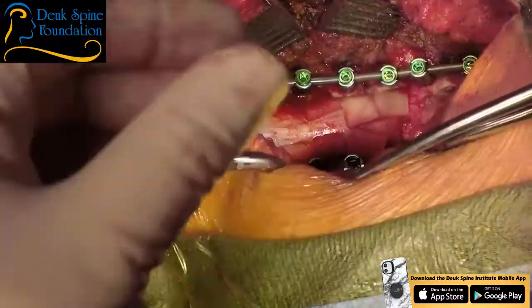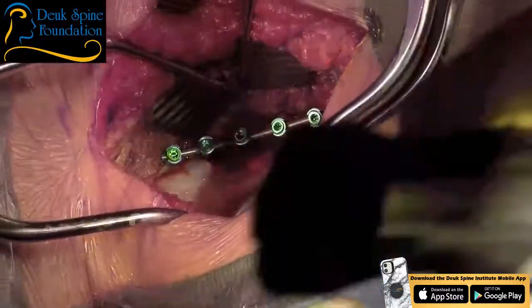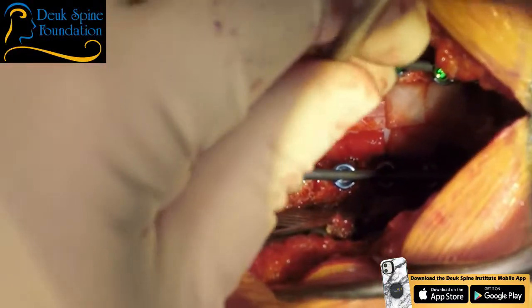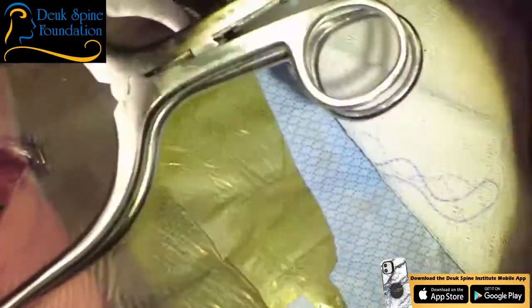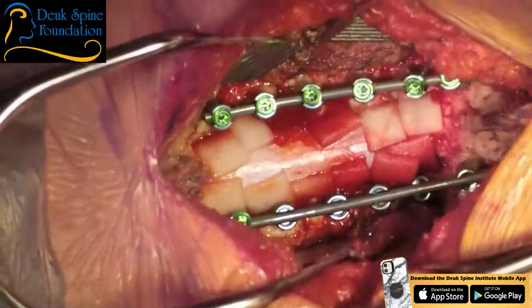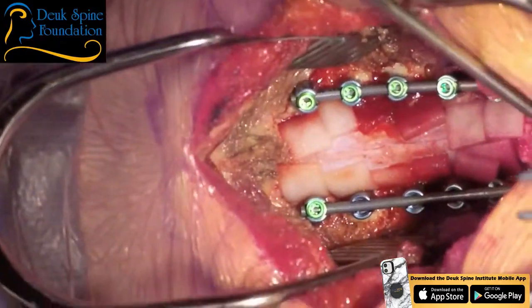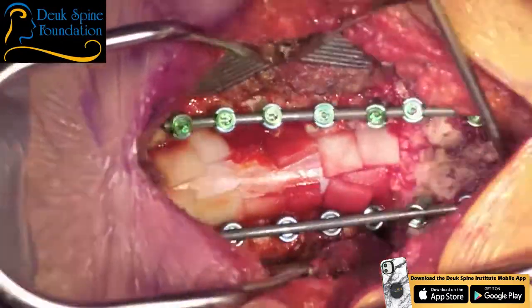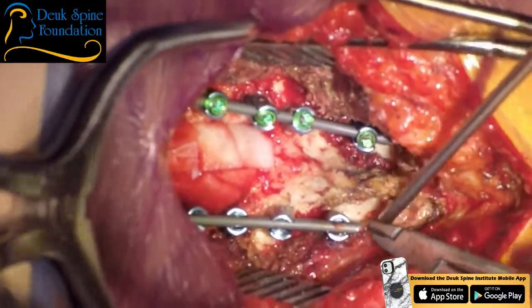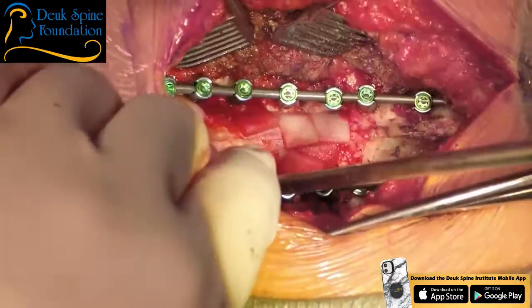All right, we're ready for our set screws. Everyone sees the spinal cord, right? I'm going to irrigate in a minute. I need to push this rod north. Let me have the needle holder. I don't need a persuader, not yet. That should be good, right? That looks pretty good, right? Maybe there. Is that loaded here? Gosh, I've got two step ups.